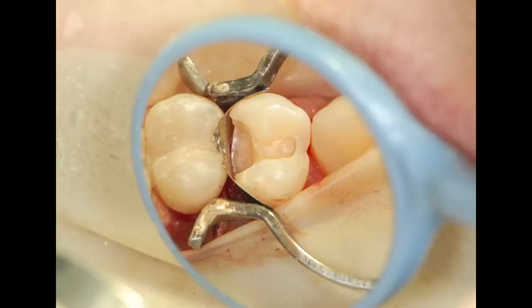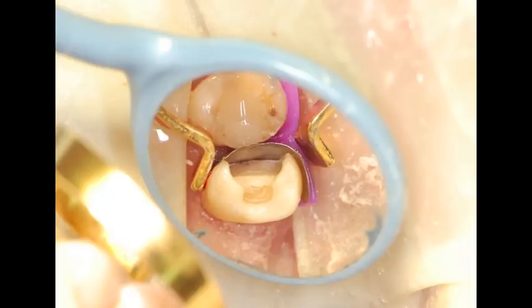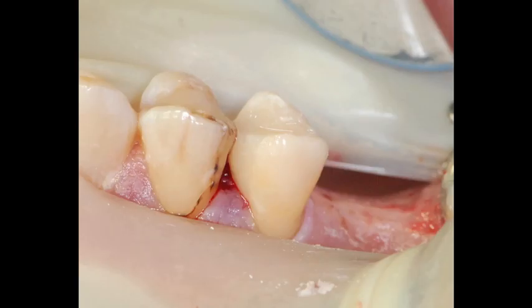Utilizing the ABC wedge system allows you to think differently. There is a clinical situation with a v-shaped ring that fits over the wedge, sealing off the cavity surface margins, but in actuality prevents the wedge from sealing the gingival floor line angle. The v-shaped ring fits over the traditional triangular shaped wedge, keeping the wedge perfectly straight, and the lower fork of the ring prevents the matrix band from adapting to the tooth. Utilizing one large right ABC wedge allowed me to use a posterior composite and restore this tooth back to form and function, maintaining a tight contact.